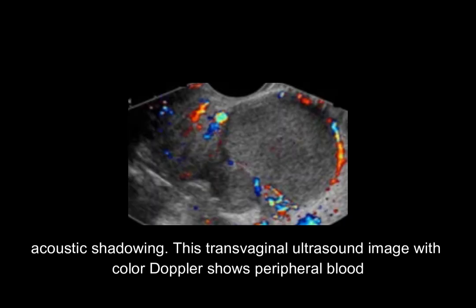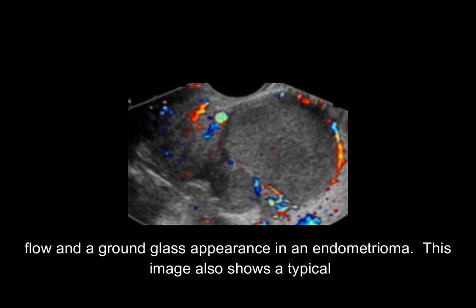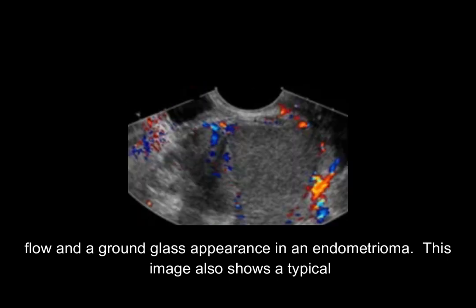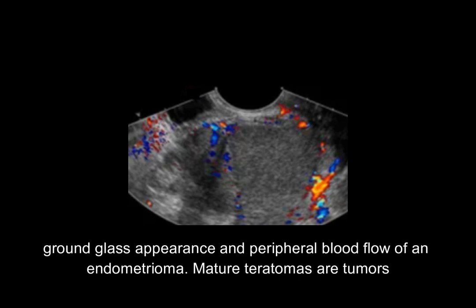This transvaginal ultrasound image with color Doppler shows peripheral blood flow and a ground glass appearance in an endometrioma. This image also shows a typical ground glass appearance and peripheral blood flow of an endometrioma.